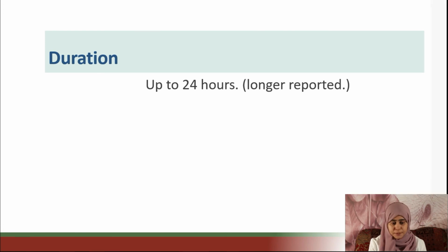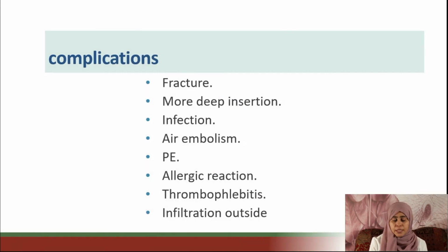We can use it. Are there any complications? Yes, there are complications of using intraosseous access. It may cause fracture, too deep insertion, infection, air embolism, PE, allergic reaction, thrombophlebitis, and infiltration outside.